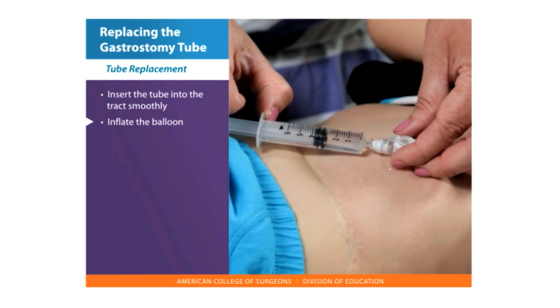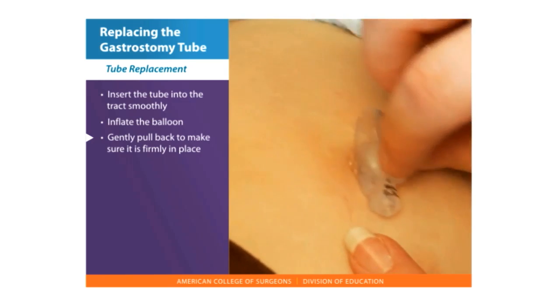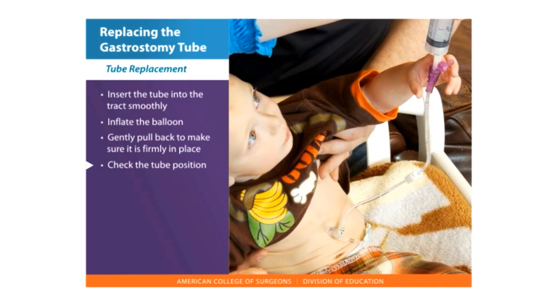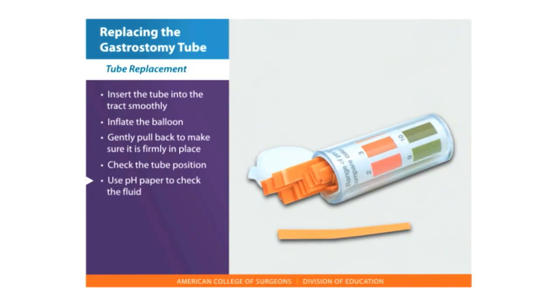Inflate the balloon with the amount of water marked on the balloon. Gently pull back on the tube to make sure it is firmly in place. Check the tube position by attaching a syringe to the feeding portal and pulling back to see if there is any gastric fluid. Check the fluid with the pH paper — a pH of less than 5 with clear to light green contents indicates stomach placement. If you do not see stomach contents or feeding return, retry or call your health care provider.